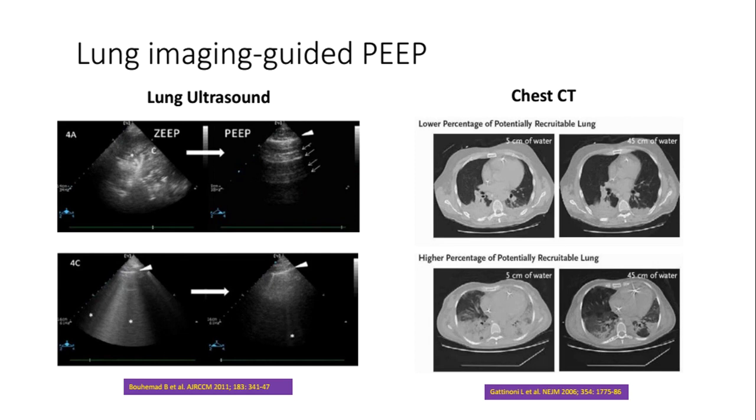No, these are the patients whom you will make prone. Right? So they are going to just reverse the entire thing, and that is going to benefit this subset of patients. So for patients with predominantly posterior disease, proning is a good option. Patients with global uniform disease, more anterior, less posterior, or generalized, here a high PEEP strategy can be used. So this is how it suggests to you that this patient may benefit from proning, this patient may benefit from a high PEEP strategy, or this patient may benefit from a low PEEP strategy.